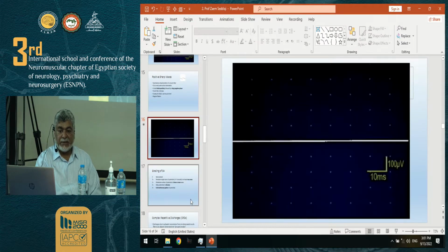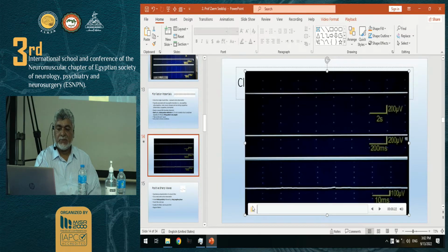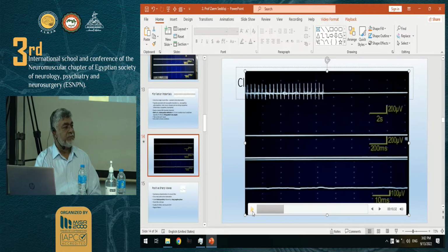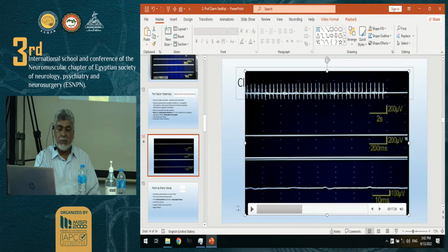As compared to, and here is something different. And this one, you can hear it. It fires very regularly and slowly goes away. Like a clock. Nothing else fires like this except a fibrillation. You just hear that sitting in another room and you know it's a fibrillation firing. Very regular, like a clock. And if I look at it for quite some time, after a minute, the firing frequency slowly reduces and it slowly disappears. Hallmark of fibrillation. Good? Okay.